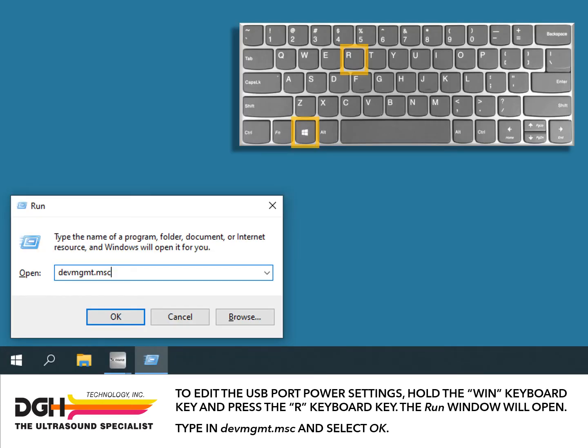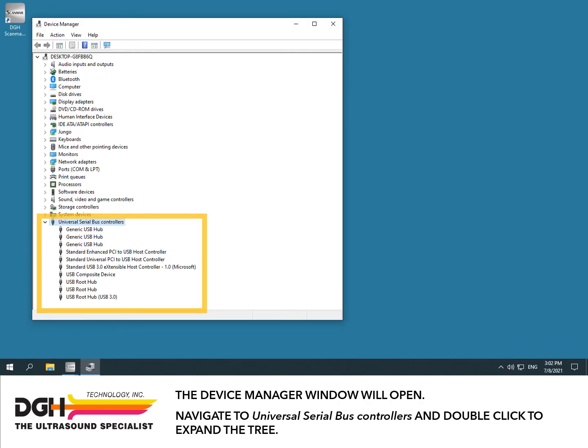To edit the USB port power settings, hold the Win keyboard key and press the R keyboard key. The Run window will open. Type in devmgmt.msc and select OK. The Device Manager window will open. Navigate to Universal Serial Bus Controllers and double-click to expand the tree.